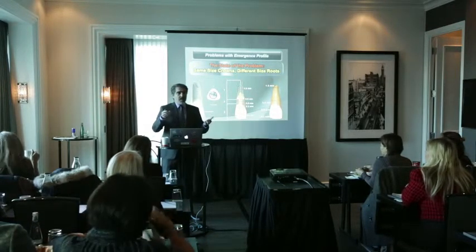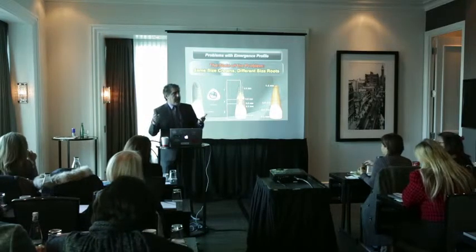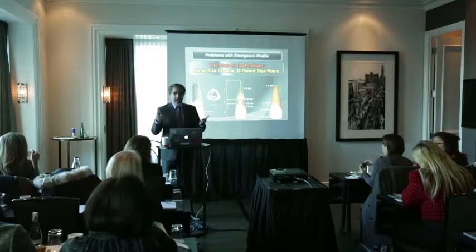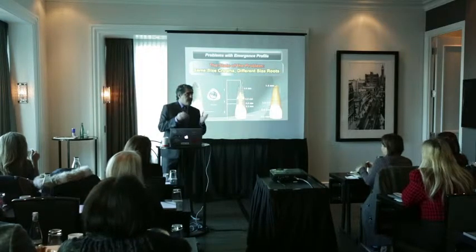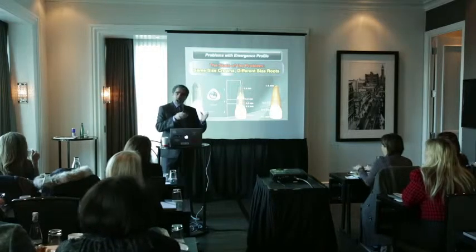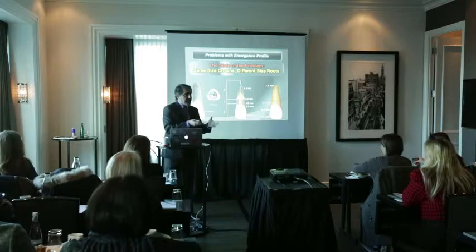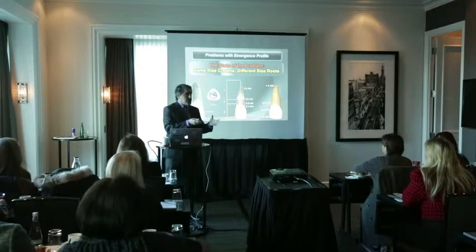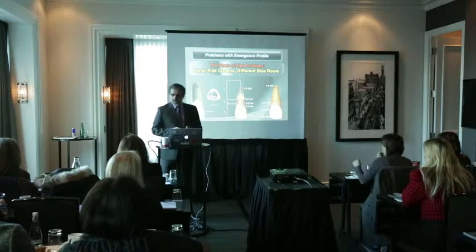You cannot ignore the prosthetic part, which is the emergence profile. You have to be careful with that. You can place very small implants, but if you want to place large implants, then you run out of bone, and there is a better chance that you lose some bone. The patient would have bone loss over time.